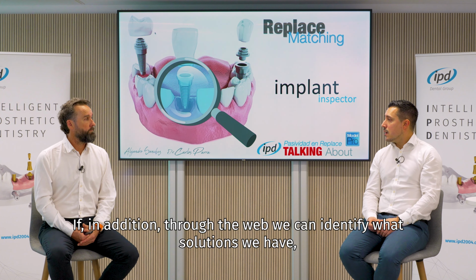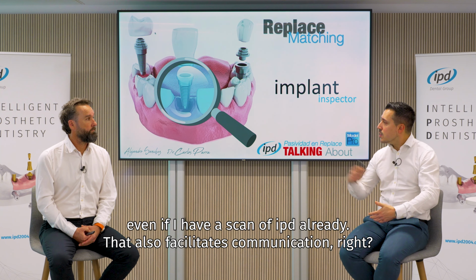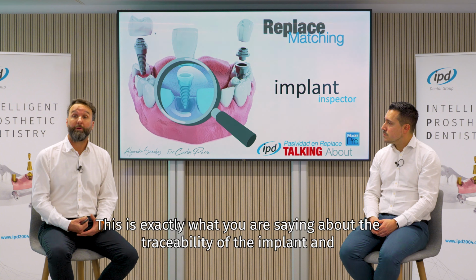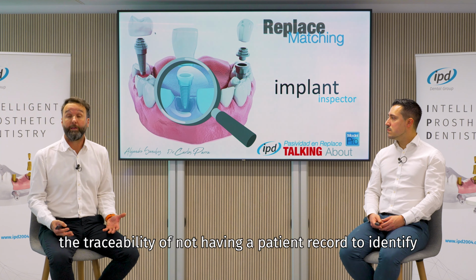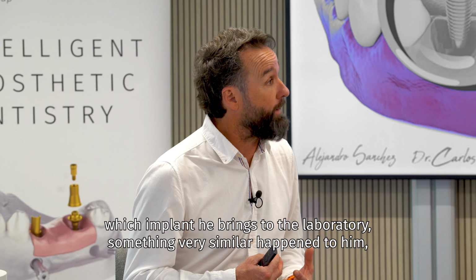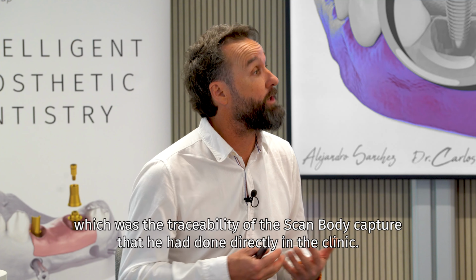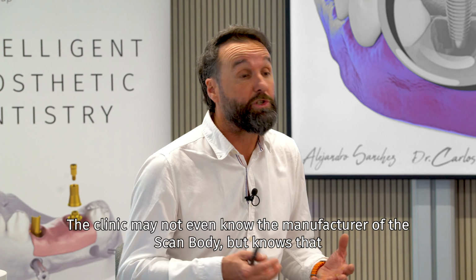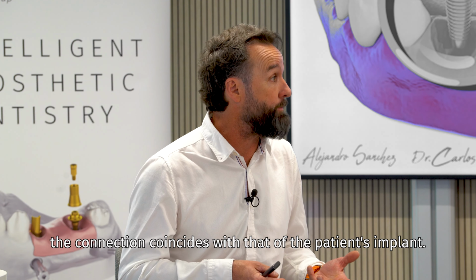If in addition, through the web, we can identify what solutions we have, even if I already have a scan of IPD, that also facilitates communication, right? This is exactly what you are saying about the traceability of the implant, and the traceability of not having a patient record to identify which implant he brings to the laboratory. Something very similar happened to him, which was the traceability of the scan body capture that he had done directly in the clinic. The clinic may not even know the manufacturer of the scan body, but knows that the connection coincides with that of the patient's implant.